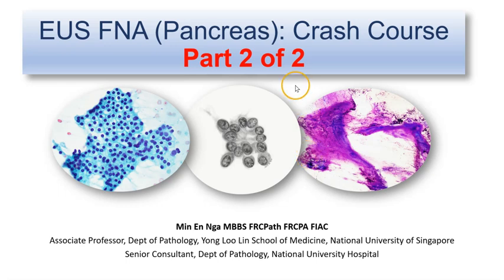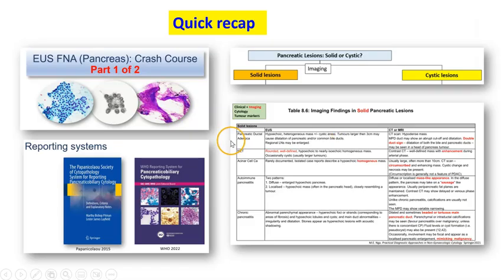Hello, this is part 2 of our two-part video series on a crash course on endoscopic ultrasound-guided FNA, or EUS-FNA, of the pancreas. Let's have a quick recap. In part 1, we looked at the major reporting systems that are in use, that is the Papanicolaou Society and the WHO reporting system, and we highlighted some of the main differences.